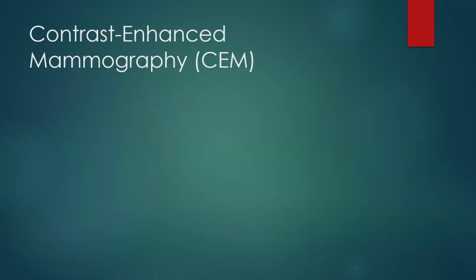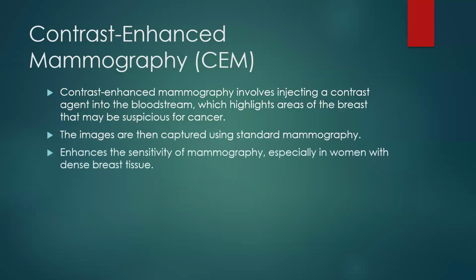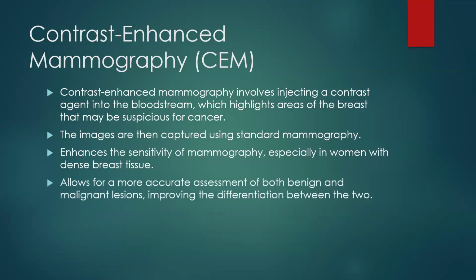Contrast-enhanced mammography involves injecting a contrast agent into the bloodstream, which highlights areas of the breast that may be suspicious for cancer. The images are then captured using standard 2D mammography. It enhances the sensitivity of mammography, especially in women with dense breast tissue. It allows for more accurate assessment of both benign and malignant lesions and improves the differentiation between the two.